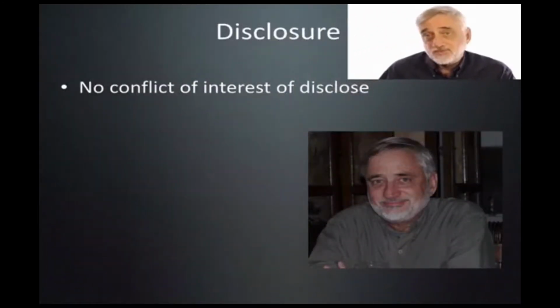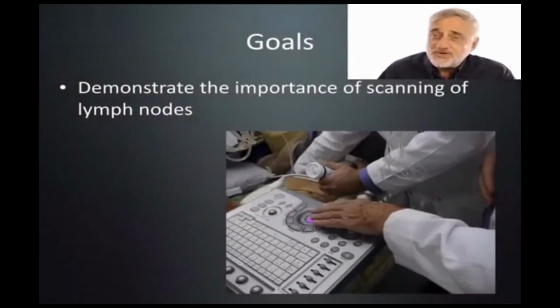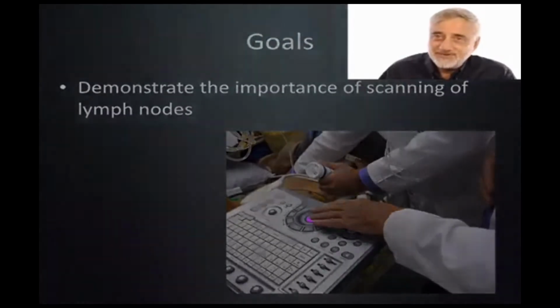I doubt that many of us lie awake all night thinking about our lymph nodes. However, we are all called to scan lumps and bumps throughout the day and throughout our careers as sonologists and sonographers. And as it turns out, many of these lumps and bumps actually wind up being lymph nodes, normal and abnormal. Well, in this section, we will talk about the secrets of the lowly lymph node.